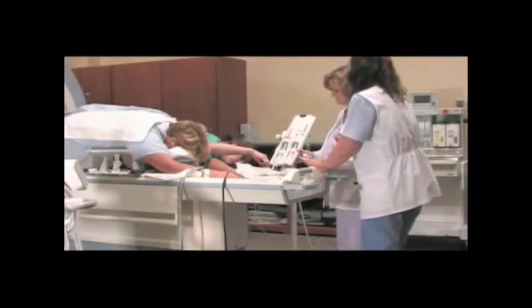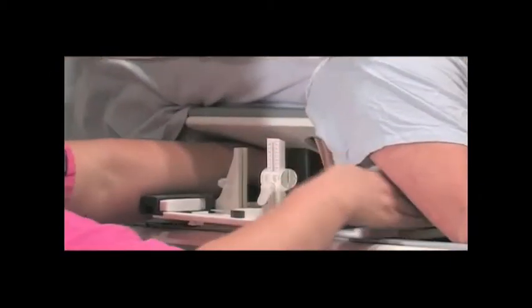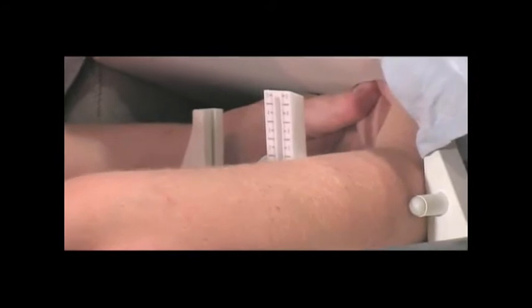The patient should be reminded of the importance of remaining still during the procedure. Clean the patient's breast and position in the breast coil with enough compression to immobilize the breast. Be sure the breast tissue protrudes through the immobilization plate. The skin surface should be taut in the immobilization plate and clearly protruding.